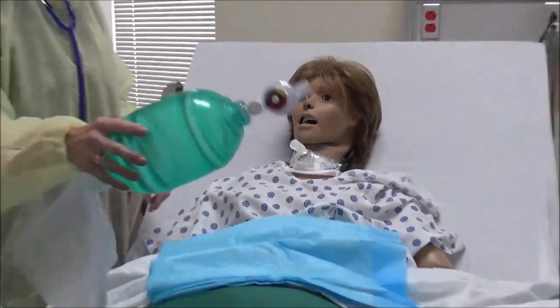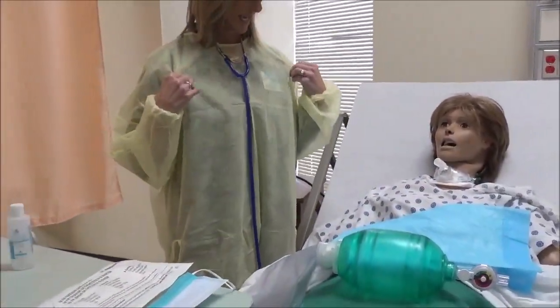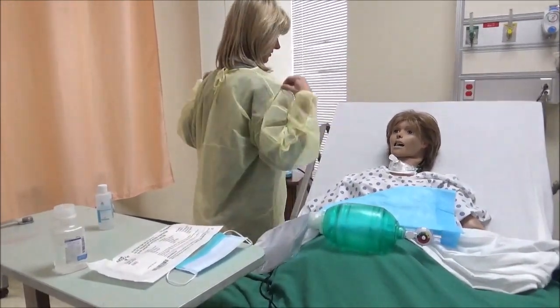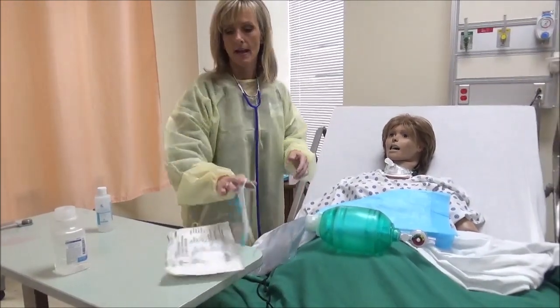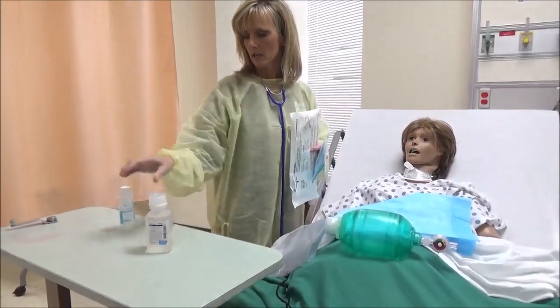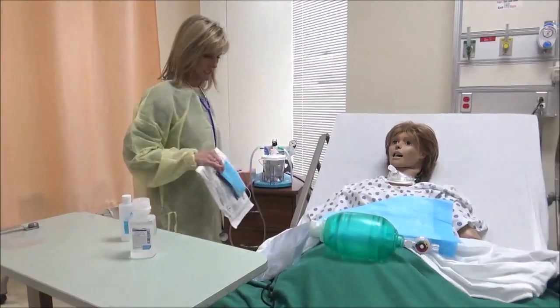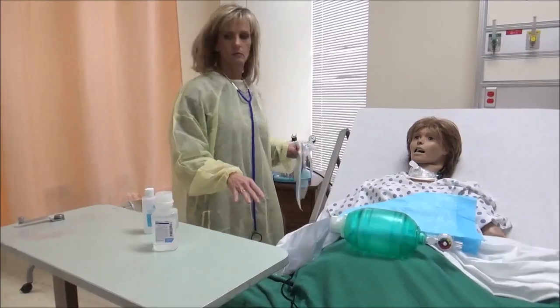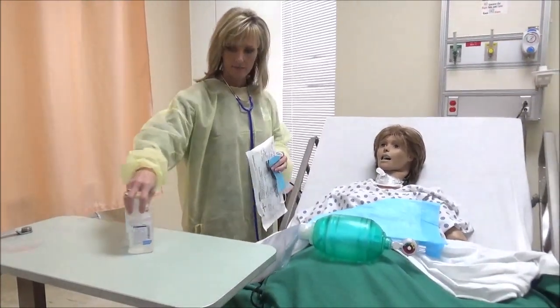I've got my ambu bag, I've got a drape, I've got obviously my gown on, which is optional for clients. Make sure it's tied and secured in the back so it doesn't fall over. I've got my stethoscope so I can assess my client. I've got my mask. I've got my suction catheter kit. I have my sterile water here. I have my method to perform hand hygiene, and I've got my suction equipment and my non-sterile gloves. I also have a garbage can down low here, so I have everything within reach for me to do this competency with.